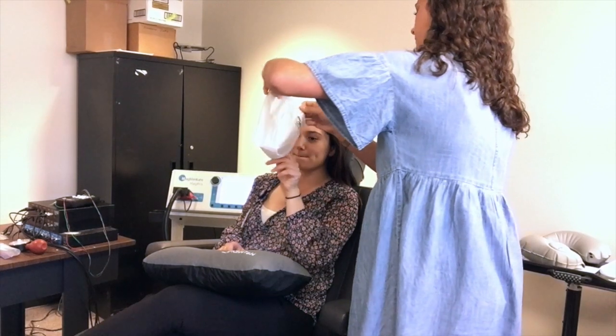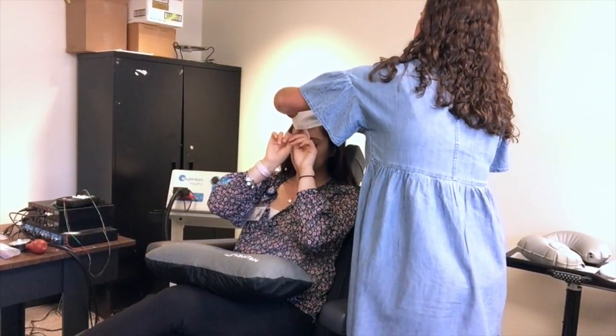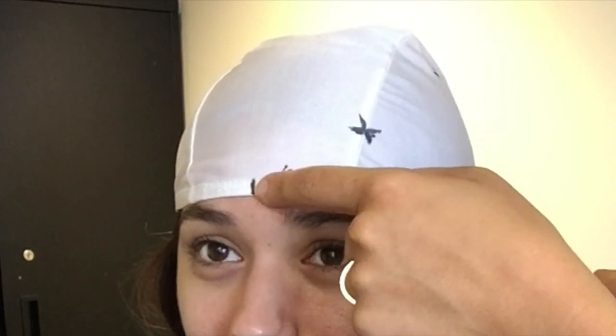When the participant is ready, we help guide on a swim cap to aid in measurement taking. It's important to make sure that their ears are visible as well. Measure from the nasion to the brim of the cap so we can place the cap in the same location every time.